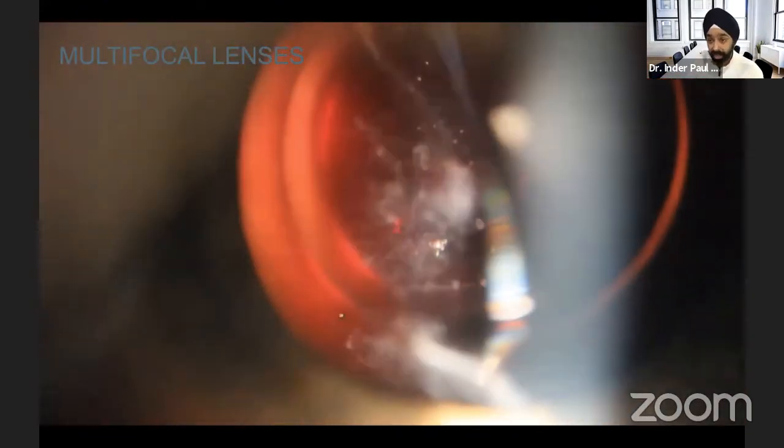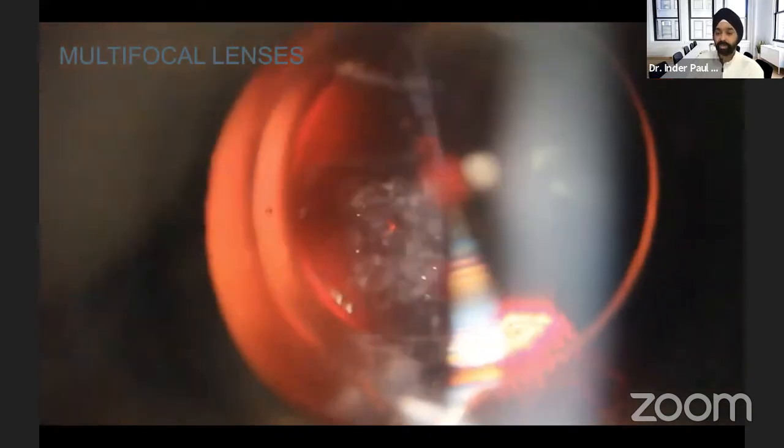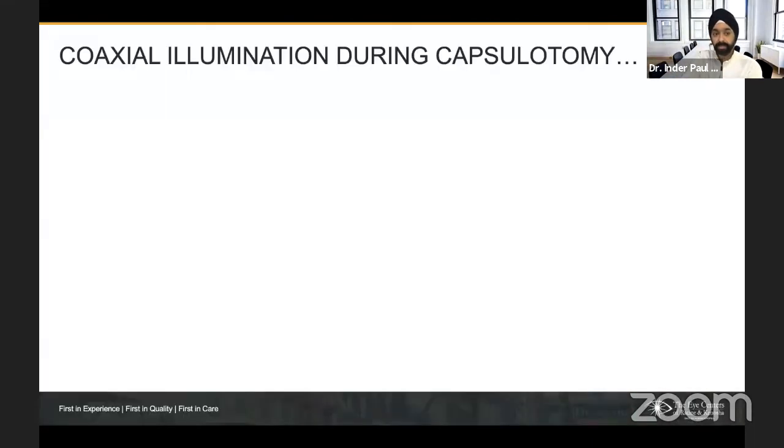And we've done a study we published a couple of years ago at ASCRS showing that we've improved reading by 2 lines with these amorphous clouds that are in the middle of the vitreous just by taking care of the floater. So from a quality of vision standpoint, especially with these multifocal lenses, these amorphous clouds can make a big difference. So even through multifocal lenses, we can see a big difference as well.